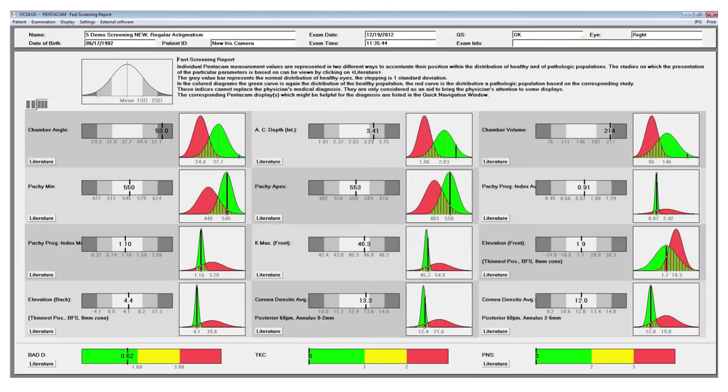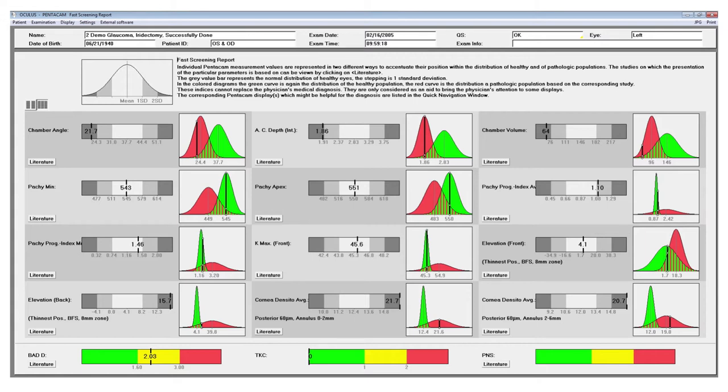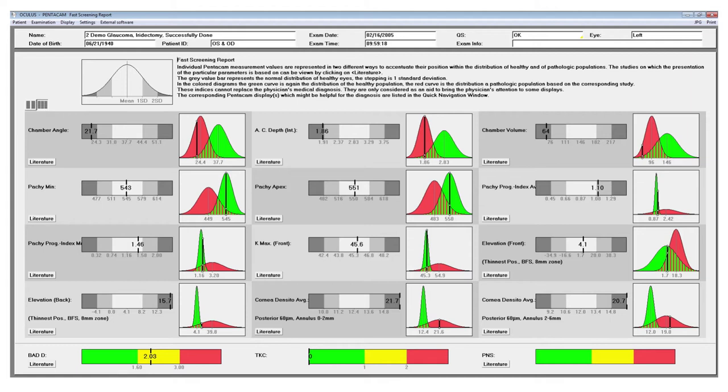We also have some statistical analysis. This is our fast screening report. The fast screening report takes several of the Pentacam measurements and shows them against normative data. The green curves that you see on the screen, that is a distribution of measurements for a normal population. The red curve is a distribution for a pathological population. And then you see the black line which is the patient and you can see how they relate to those two populations.